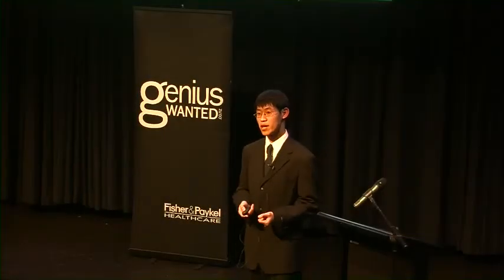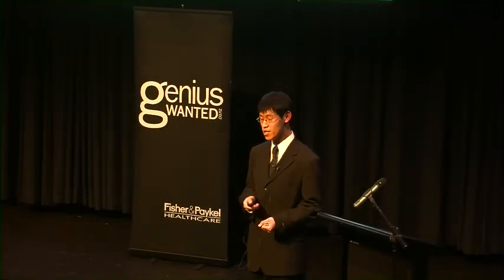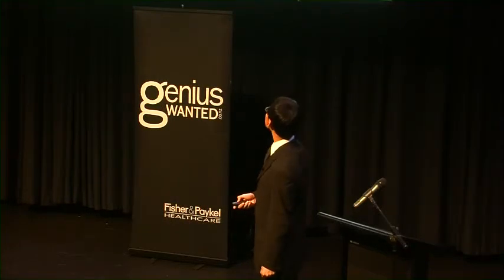So in summary, I've told you that phase contrast is a highly accurate method for quantifying flow, provided we fix the background phase problem. Current research shows that background phase is the most common source of error, and it's caused by unintentionally induced eddy currents. Now, my experiments have shown that background phase is geometrically simple, and that we can also very accurately predict it using mathematical models, but the time stability is uncertain.